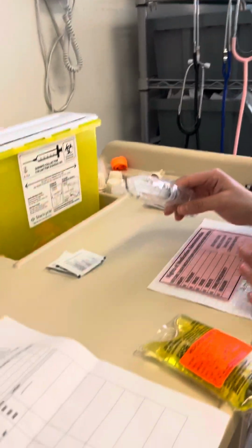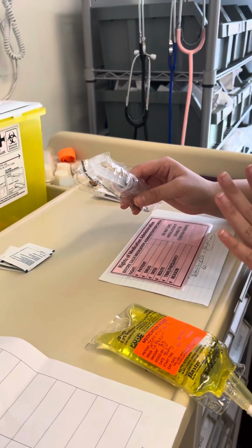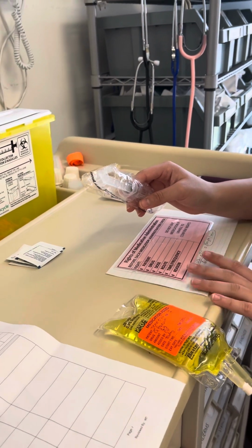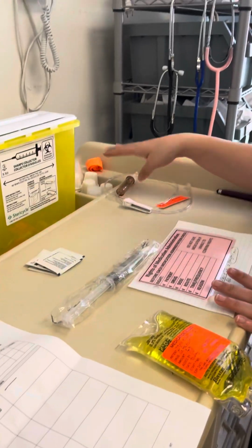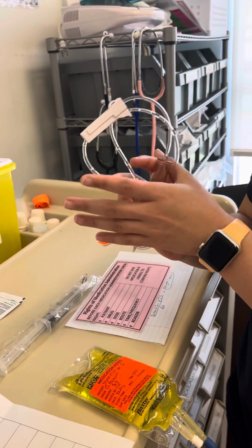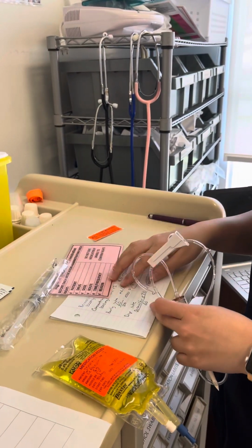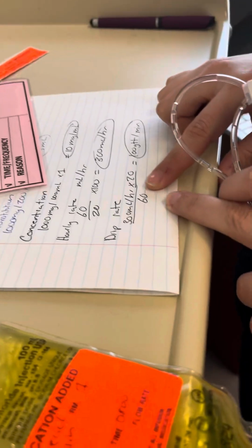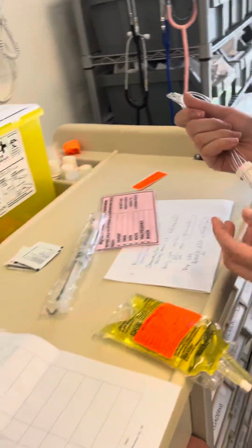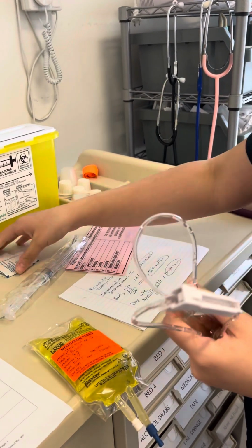So what I'm gonna do when I go into the patient's room is I'm gonna introduce myself, explain what I'm doing, get the patient's ID. I'm gonna flush the IV, prime my second line. So this would be new in a bag, and it would have a drop factor on the back, which would help us determine the drip rate here. So we're just assuming it's 20 because we don't have the bag. There would be a cap over this and a cap over that, which means they would both be sterile.